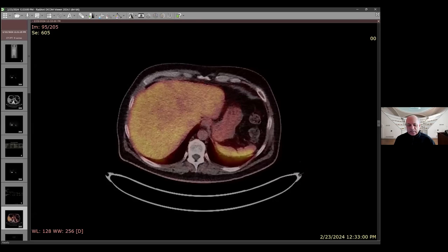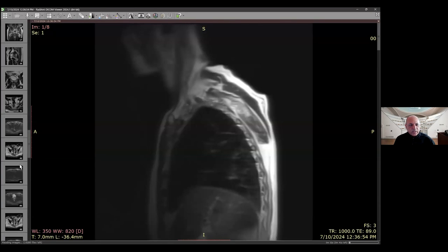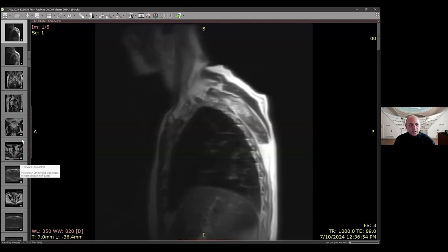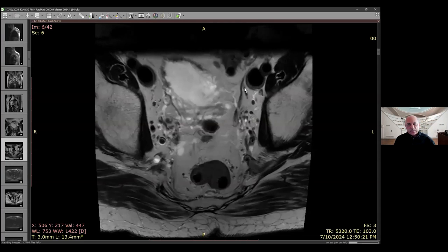Moving on to the second case — this patient is around 60 years old with a PSA value of 4.8 and a PSA density of 0.07. So PSA density is not very high. The question is: what do you do if the PSA density is low? When PSA density is high, you look very hard to make sure there is no lesion. If PSA density is not very high, you still follow the same PIRADS scheme — the value of PSA density is when it is high, not when it is low.